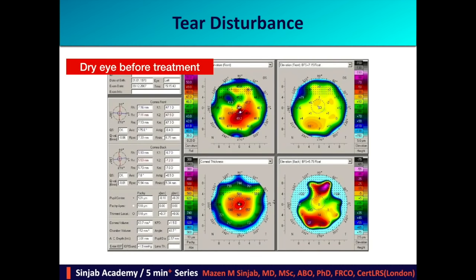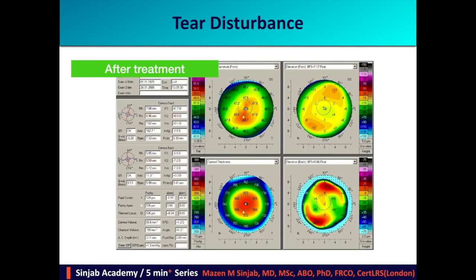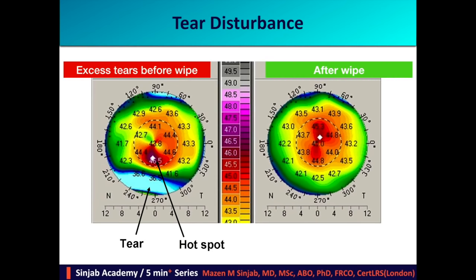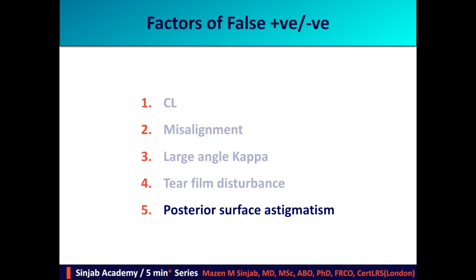Tear film disturbance: this is a dry eye before treatment — look at the irregularity and high keratometry readings — and this is after treatment. This is a case of excess tears before and after wiping the eye. Posterior surface astigmatism may affect in two ways: it affects the total corneal astigmatism and may be a factor behind disparity between topographical astigmatism and manifest astigmatism; and it affects the calculations of toric IOLs.